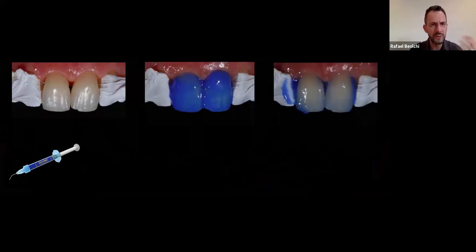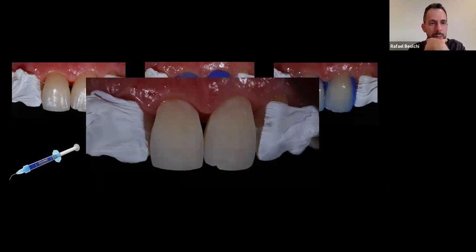should be a very firm, very strong air and water. So it's water and air at the same time, both of them at the same time. You should wash everything throughout, dry as much as you can, because this is enamel. And remember, 2 weeks from now, I want you to remember that image here, because I'm gonna bring back a little bit the subject of bonding 2 weeks from now. But in this case, it's 100% enamel.